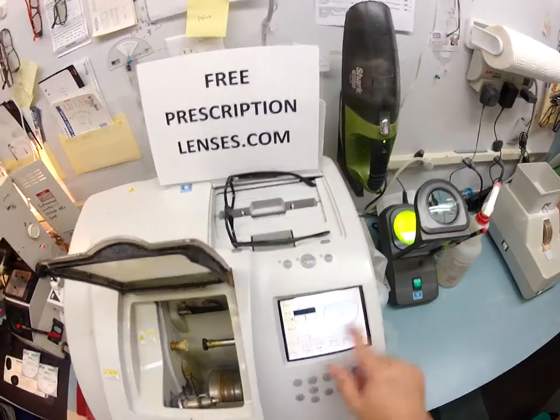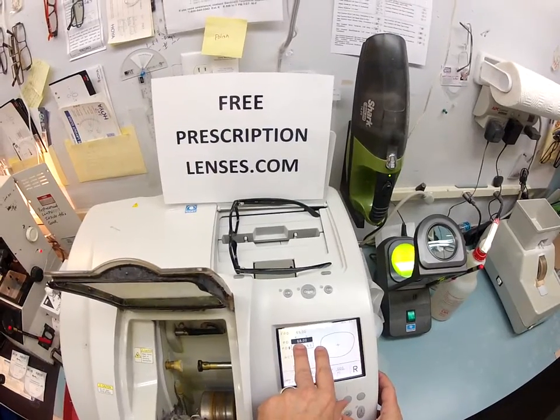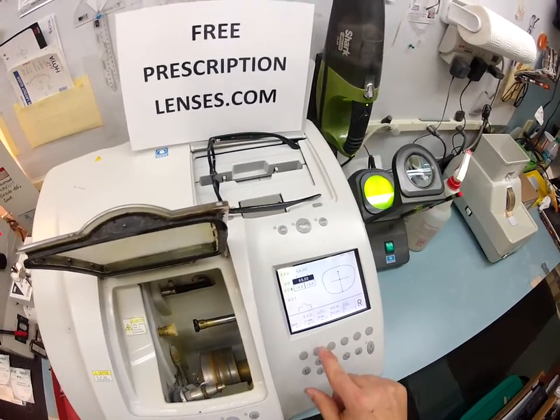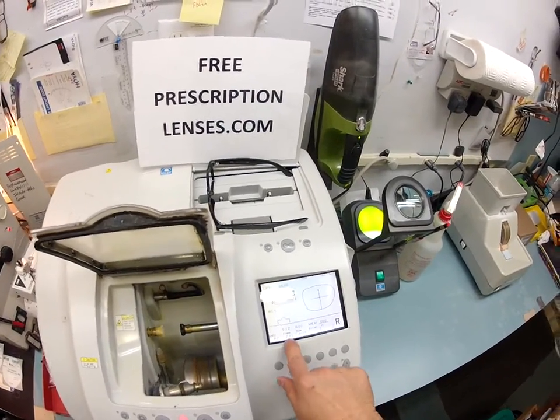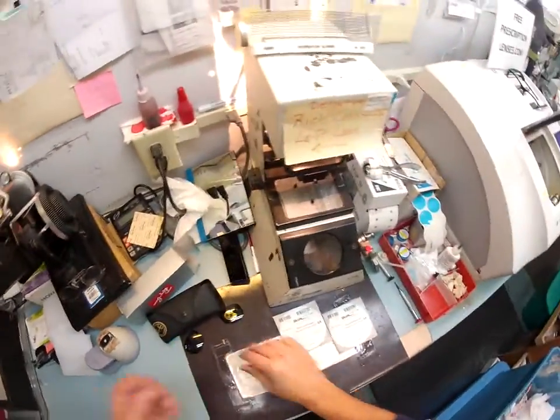So I pull up the shape of your frame. If this were a prescription, I'd put in your pupillary distance, but since it's not, I'm going to have the PD match the frame PD. This is a polycarbonate lens. I'm going to cut it on the soft cycle, and this is for a Zile frame, which is an old school name for plastic. Now most plastics are acetates.